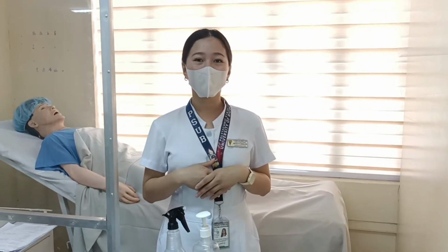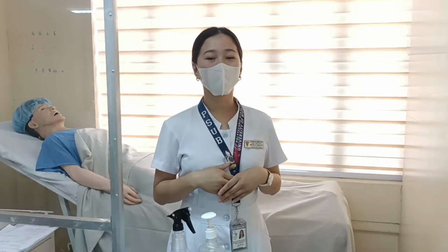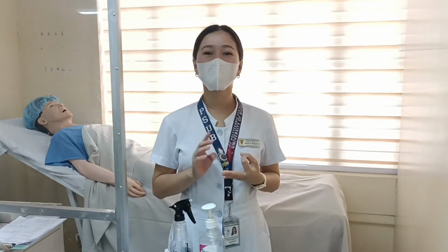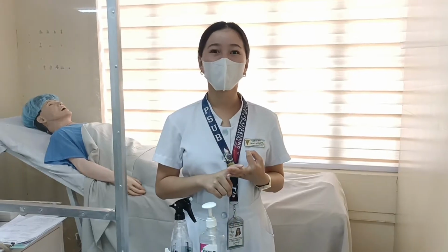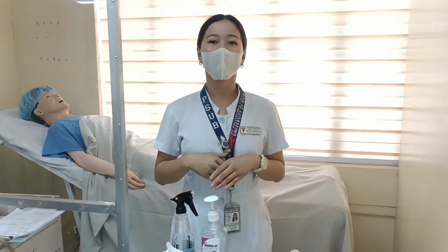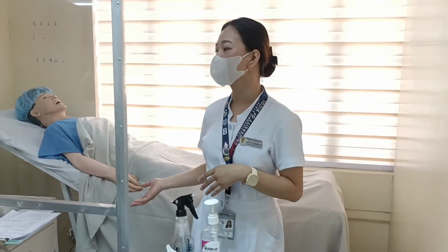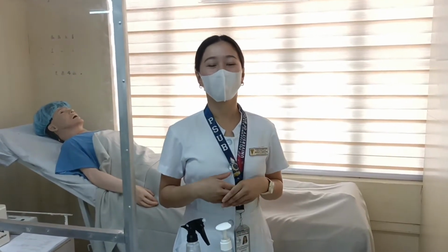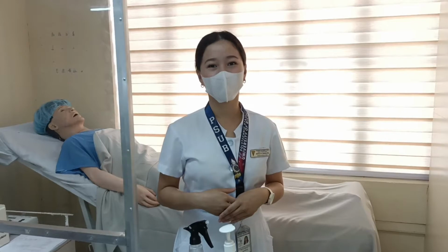So, for the first procedure, we need to verify the doctor's order for the size of the catheter, types of solution, airway to be suctioned, and the pressure to be used. Then now we are here in the patient's room. Then next, we need to introduce ourselves, verify the client's identity, and explain the procedure.